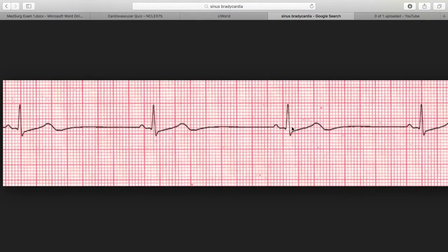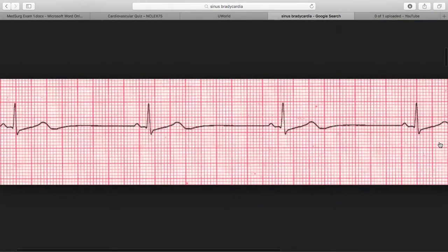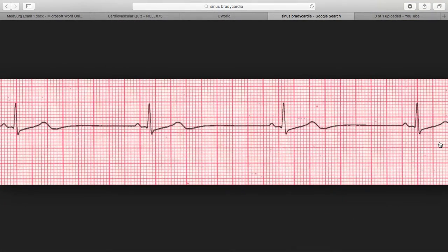But moving along, let's read this strip of sinus bradycardia. So is there a P wave? Yes, there is a P wave formed on every single one — and this is how long the strip goes. Is there a QRS? Yes, there are four QRSs. Is there a P wave with every QRS? Yes, there is a P wave with every QRS.